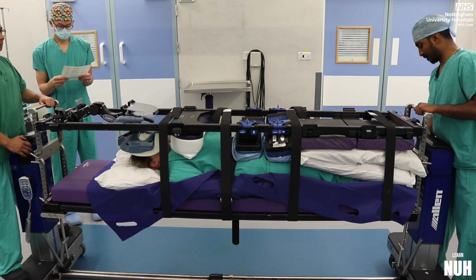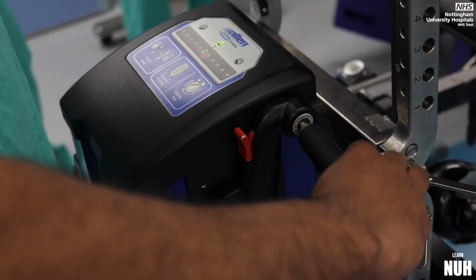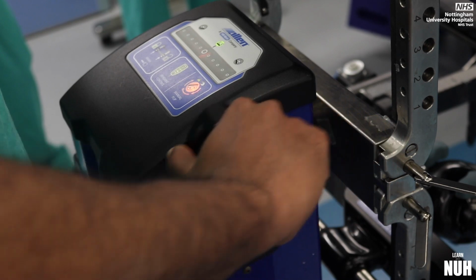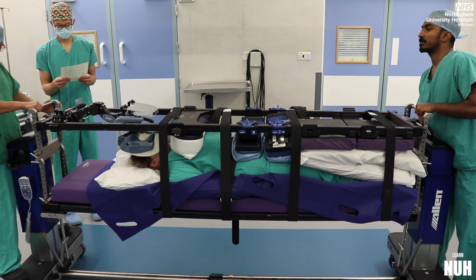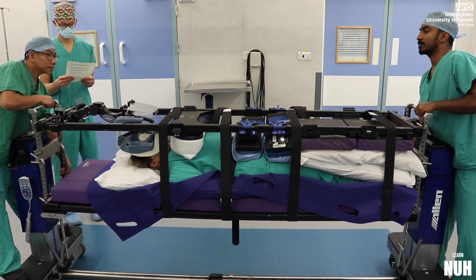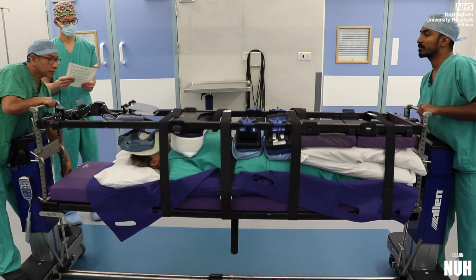While stabilizing the Allen table, release the manual flip handle, which is the red switch, and the handle should now be in the down position. Verbalize the flip countdown and direction. Disconnect the breathing circuit. 1, 2, 3, and then we'll turn after 3. Disconnect the breathing circuit. Ready then? 1, 2, 3.